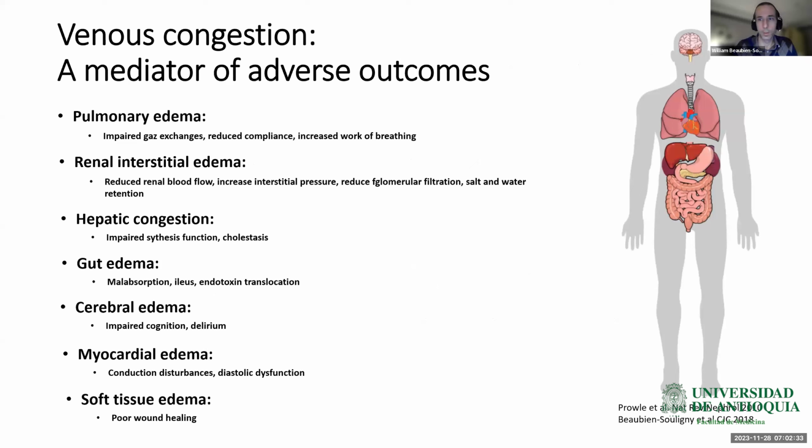When only respiratory modulations were present on femoral Doppler, the pulsatility was considered as 0%. When both respiratory and cardiac modulations were present on femoral Doppler, maximal and minimal velocities were measured at the end of expiration, which gives us a pulsatility of 33% in this example.